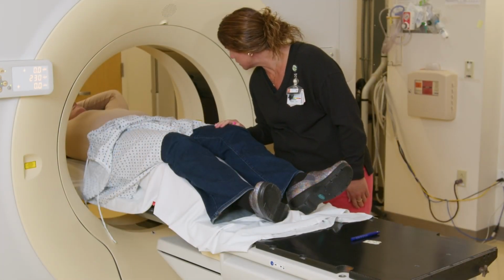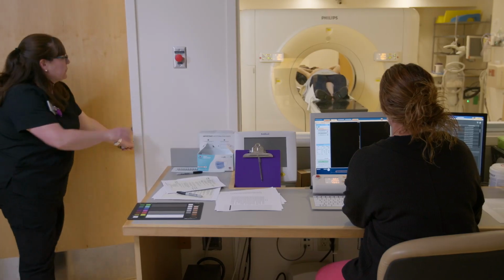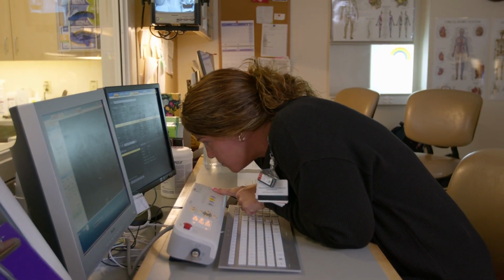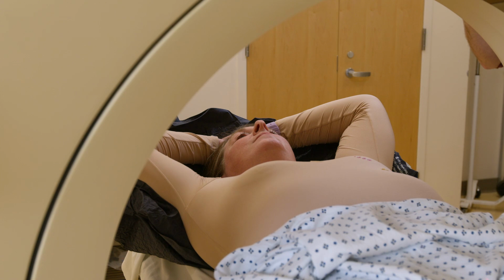They'll exit the room, but will continue to communicate to you through the intercom. They'll remain close and will be able to see and hear you. You should continue to breathe normally until you're instructed to hold your breath by the therapist. The therapist will say, "When you're ready, take a deep breath in through your nose and hold." Remember, this appointment is about you. Please take your time and try not to feel rushed.